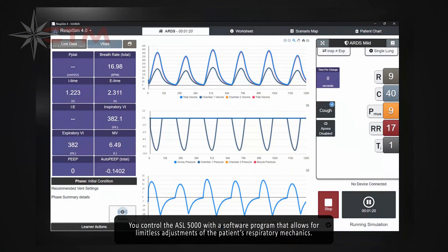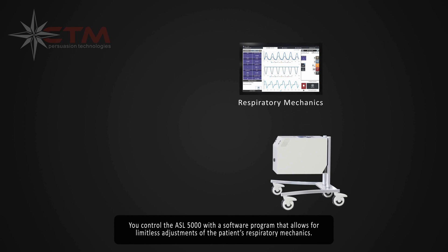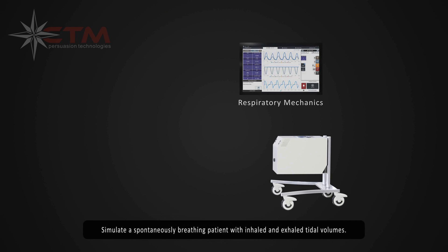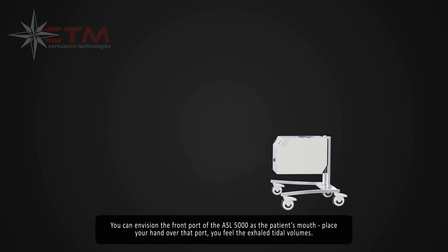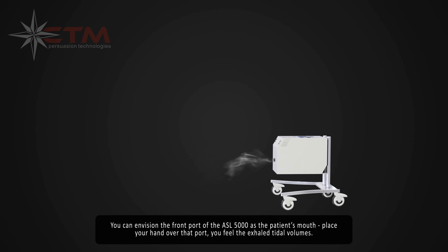You control the ASL5000 with a software program that allows for limitless adjustments of the patient's respiratory mechanics. Simulate a spontaneously breathing patient with inhaled and exhaled tidal volumes. You can envision the front port of the ASL5000 as the patient's mouth — place your hand over that port and feel the exhaled tidal volumes.